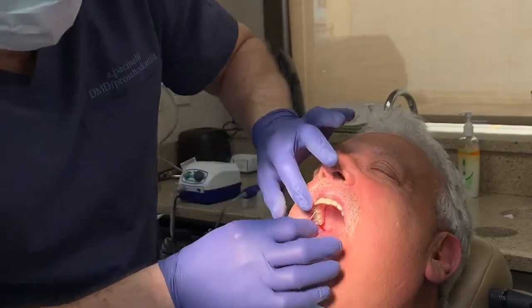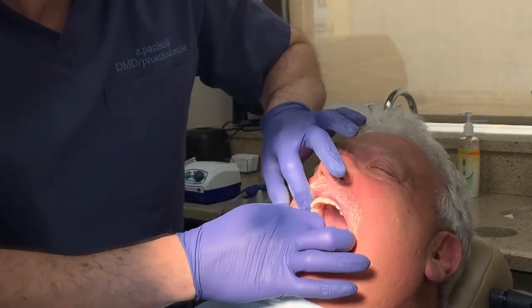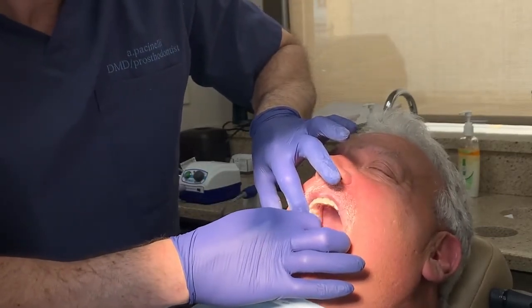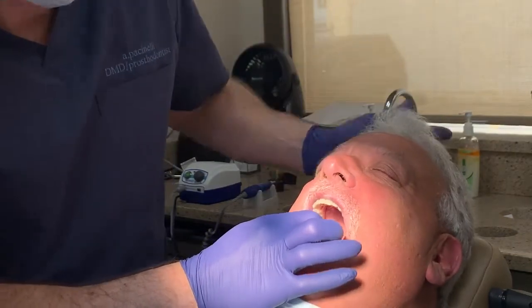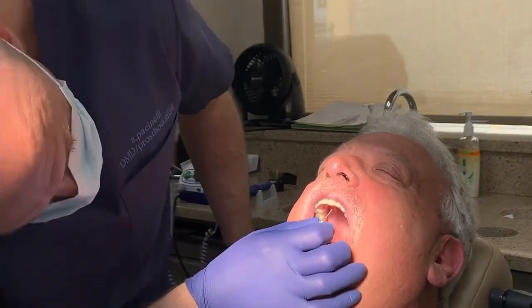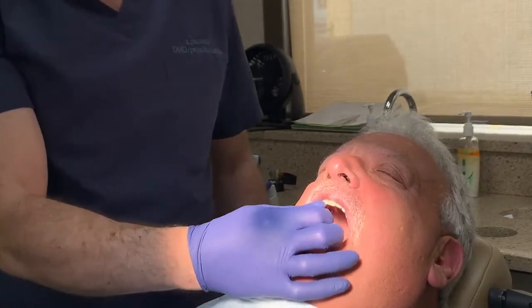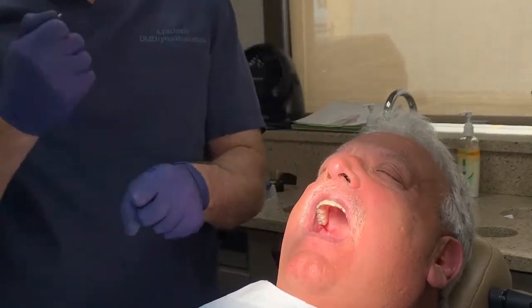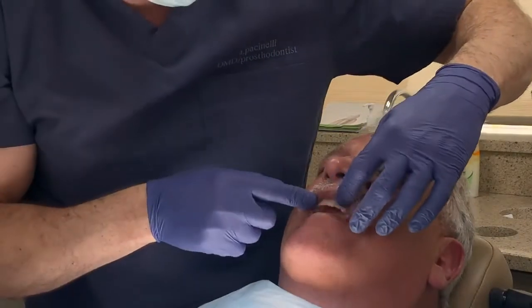Right. There are different theories on all of it. In an ideal world, it's nice to have like material opposing like material because they're going to wear. However, when you do zirconia over zirconia, the big complaint is that you hear this clanging and clacking because you're crashing super rigid, non-forgiving materials.